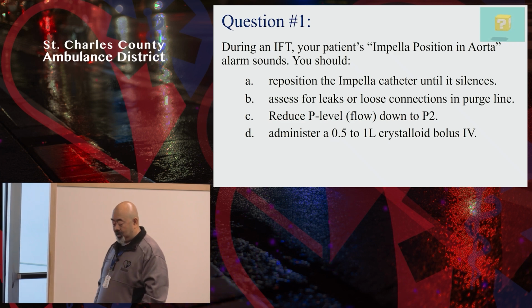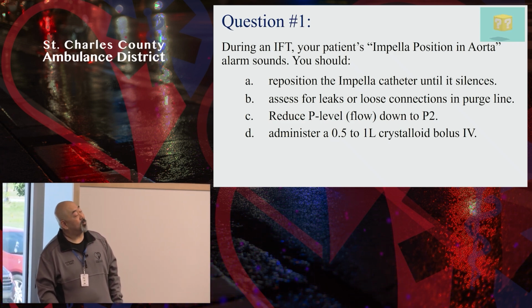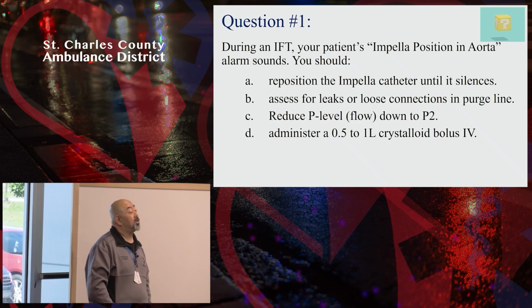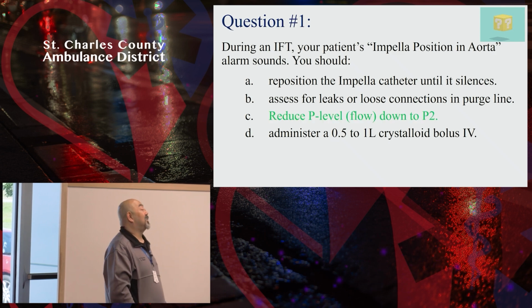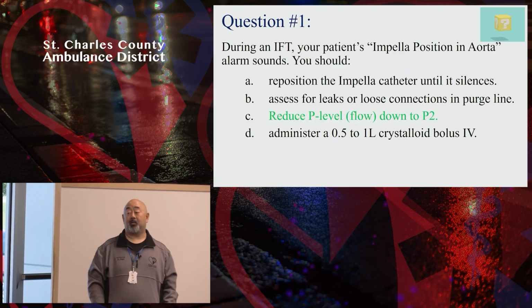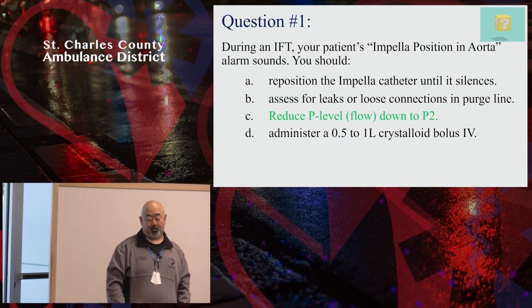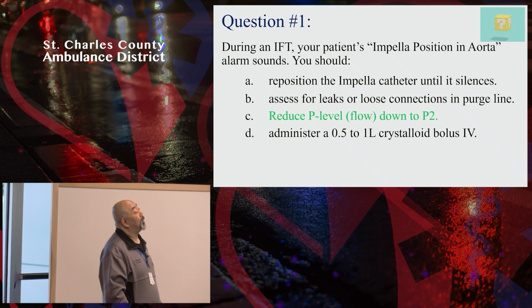During an IFT, the Impella position in aorta alarm sounds. What is the first thing that they're going to have to do when they get to the receiving facility? Check placement. And that's something they'll do well after you get them delivered.